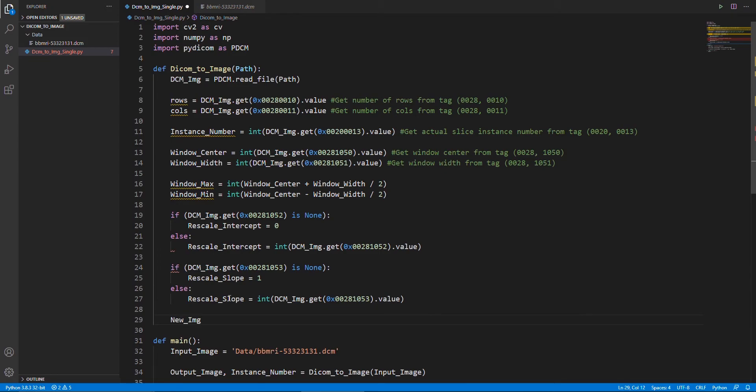Now, we will initialize a new 8-bit image with zeros, and get the pixel array from our DICOM file.